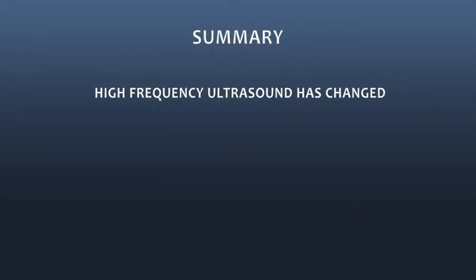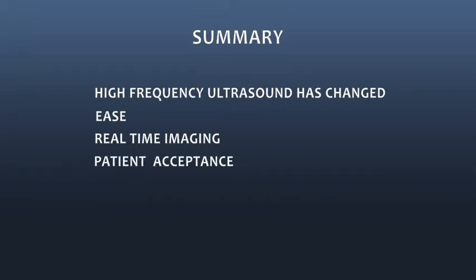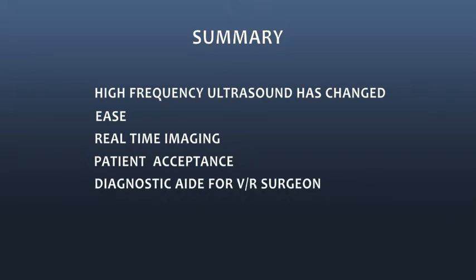So in summary, high-frequency ultrasound has become easier to perform. Real-time imaging really does change your diagnostic capabilities, since none of these changes that I've shown you would be easily visible without real-time. Patient acceptance is high, and the diagnostic aid to a vitreoretinal surgeon, I think, is pretty obvious, especially when information is needed from the anterior segment.